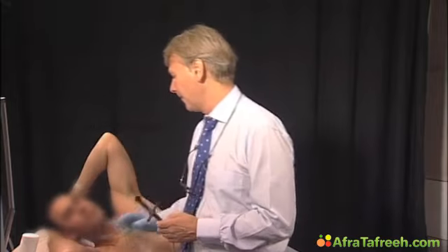We also tell the patient to raise his hands above his head. And then we place the transducer in the right intercostal space and direct the pencil probe towards the left, so towards the heart.